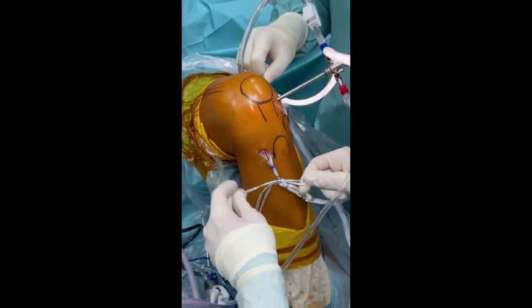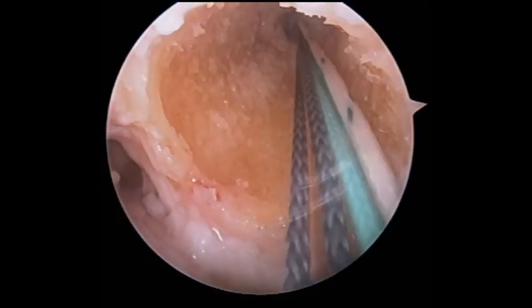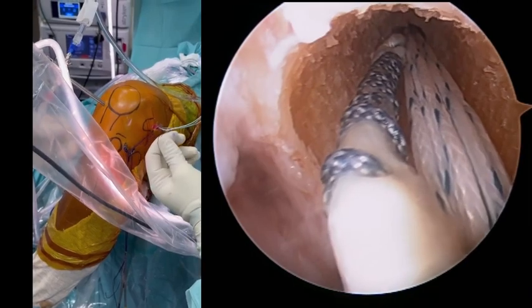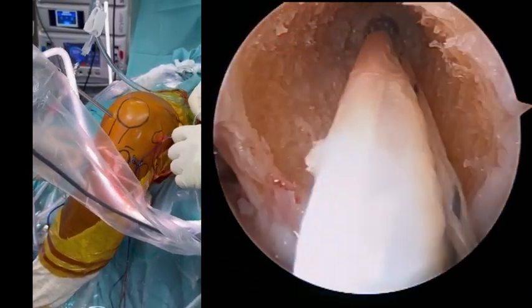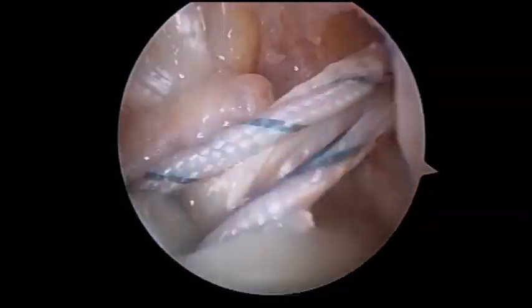The femoral adjustable graft loop is pulled through the tibial tunnel along with the graft into the femoral tunnel under direct arthroscopic visualization until the button has exited the femoral cortex and is ready to flip. Once the button flips, the graft is pulled back to ensure solid femoral fixation.